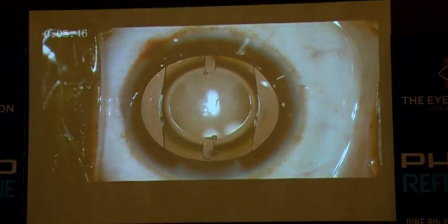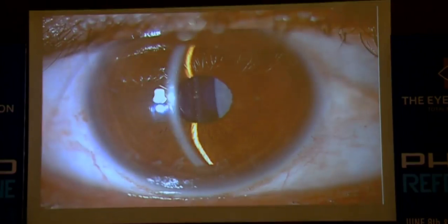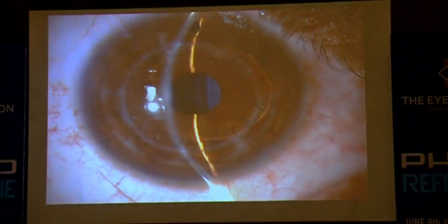And this incision, these openings are quite good, so you can wash off that. Postoperatively, you consistently get a good vault, and if you by mistake do it, you get an over vault. Otherwise, yeah, they do very well. Even we do very complicated cases like post-PK, post-DALK sort of cases. Hypermetropes, I did around 10.